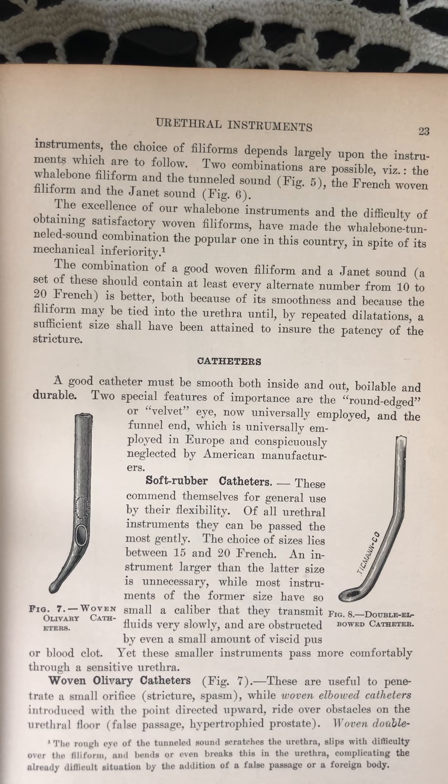Two combinations are possible: the whalebone filiform and the tunneled sound, and the French woven filiform and the Janet sound. The excellence of our whalebone instruments and the difficulty of obtaining satisfactory woven filiforms have made the whalebone tunneled sound combination the popular one in this country, in spite of its mechanical inferiority.